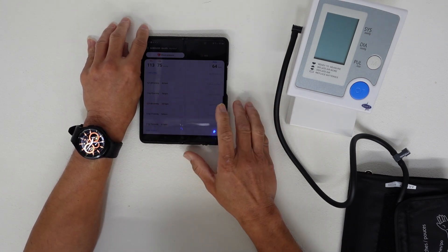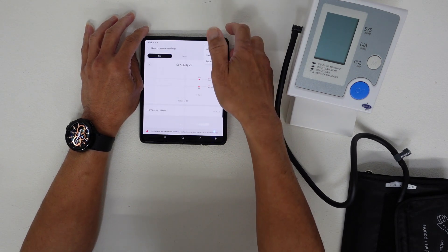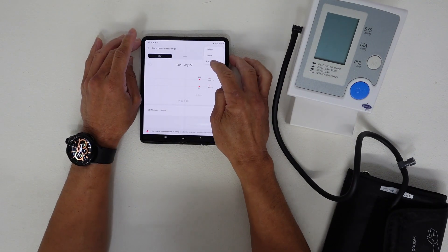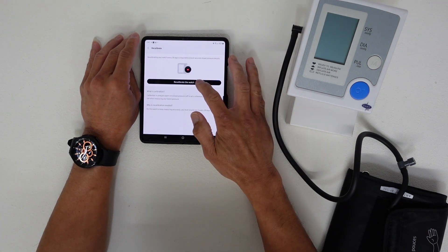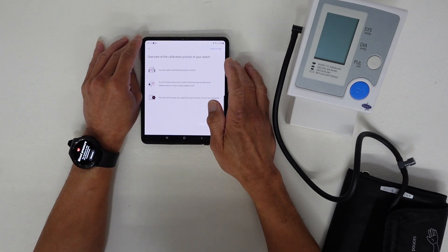What you have to do is go to Calibration in the app. If you're a first-time user, you have to calibrate it. To calibrate your watch, go to the blood pressure monitor section and then select calibrate or recalibrate.